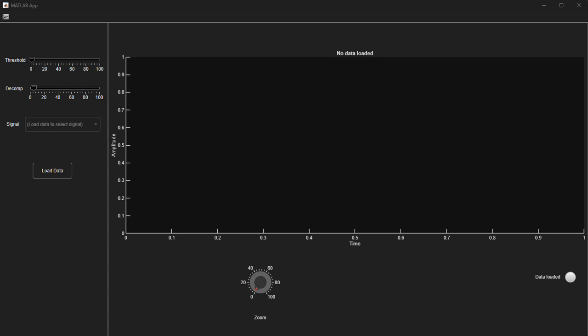The objective of the app is to decompose or perform a wavelet transform on a raw electrocardiogram signal, and we then detect the QRS complex post signal processing and plot the signals for visualization and analysis.